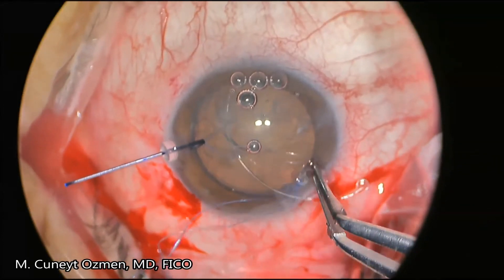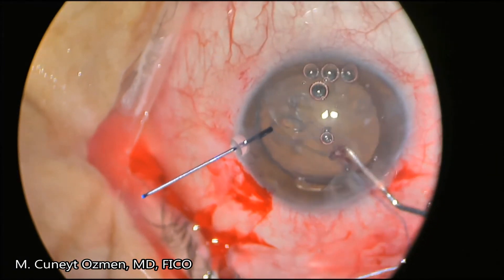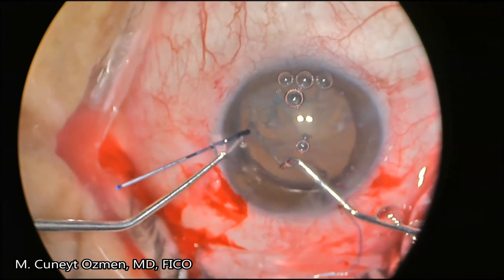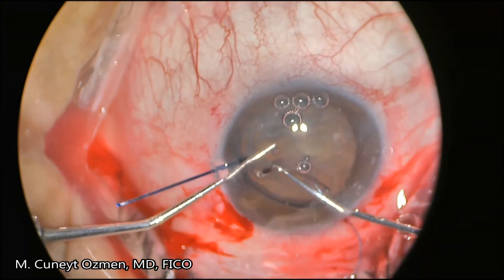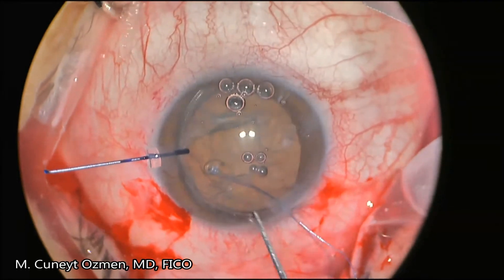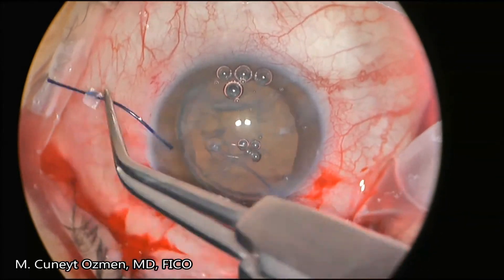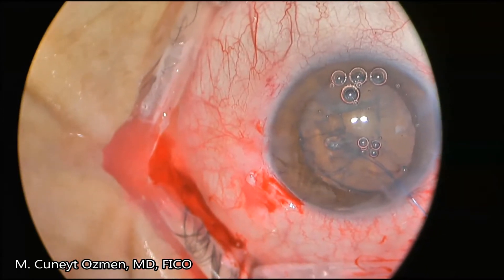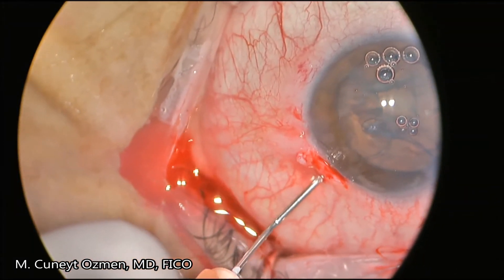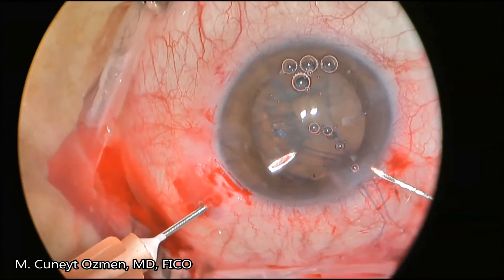After tying the sutures and locking them, we are inserting the Cionni ring into the capsular bag and dialing it so that it corresponds to the Hoffman pocket. After dialing it in place, I'm removing the iris retractor because now I'm going to be stabilizing the lens-capsule complex with the Cionni ring.